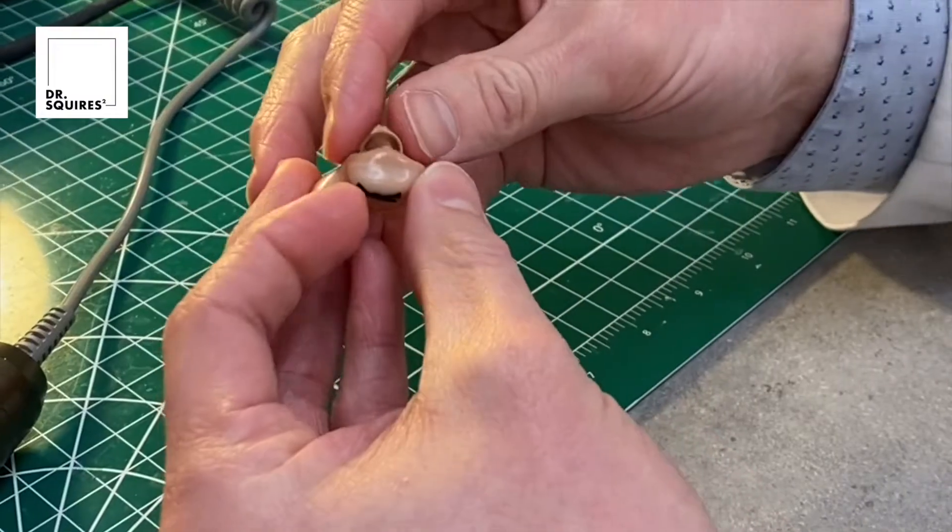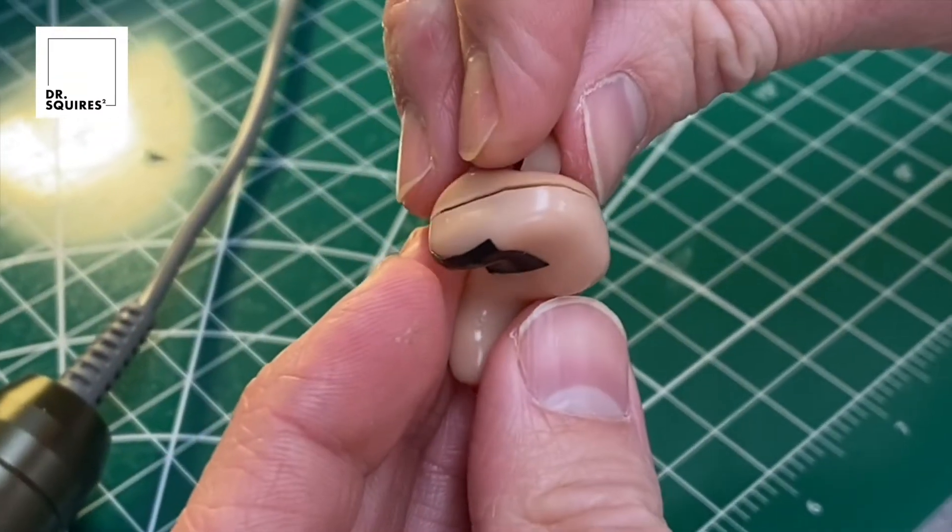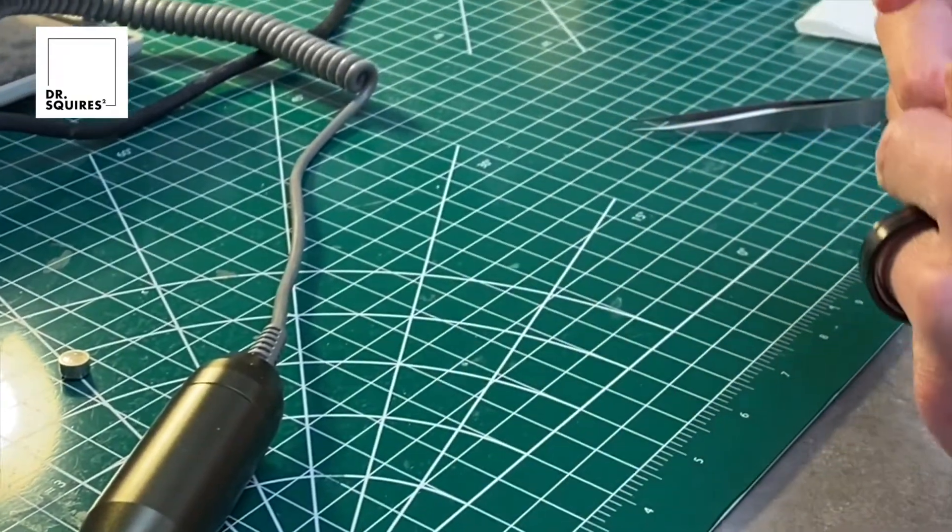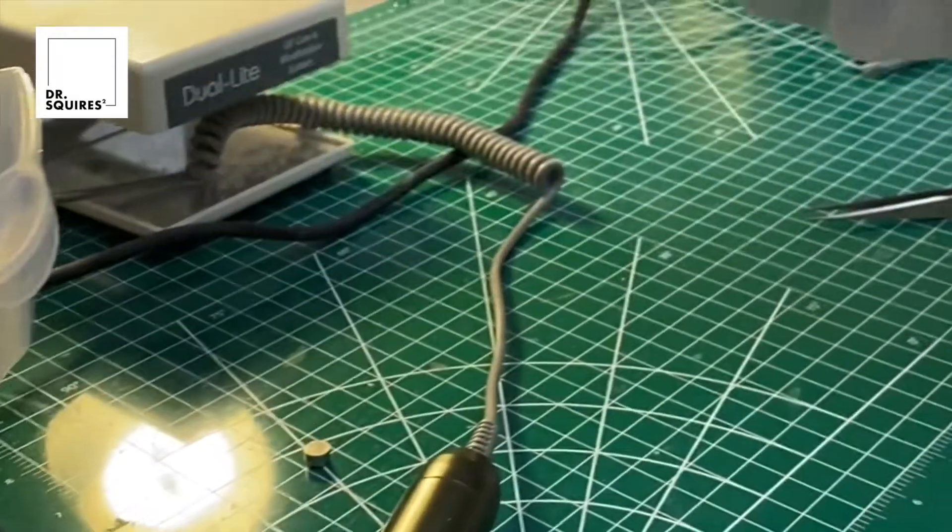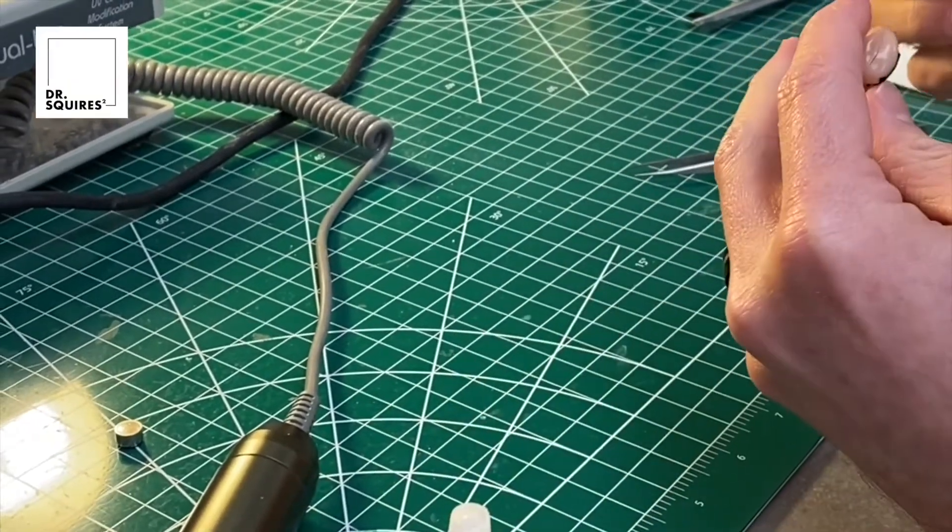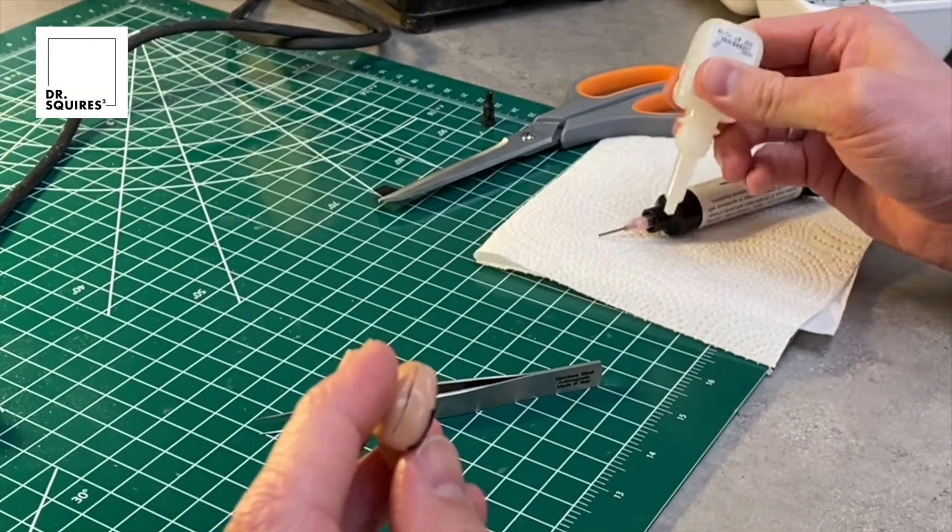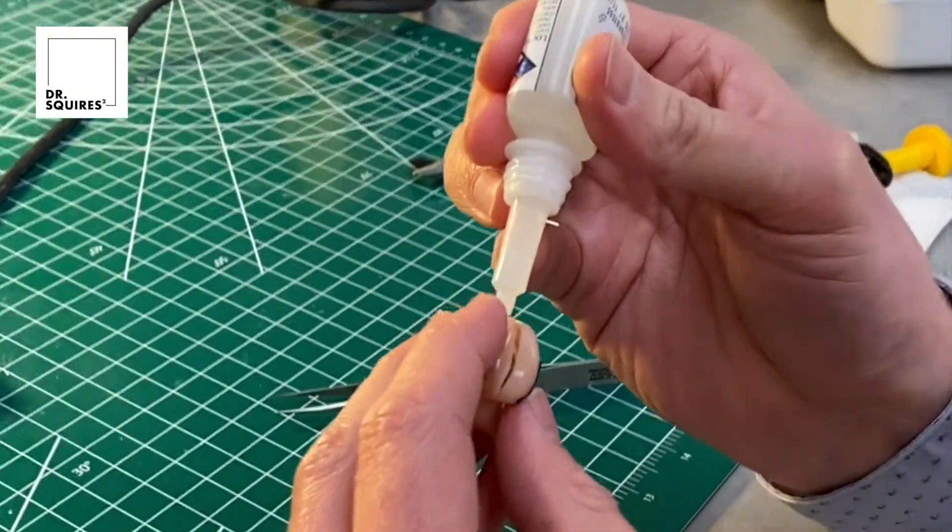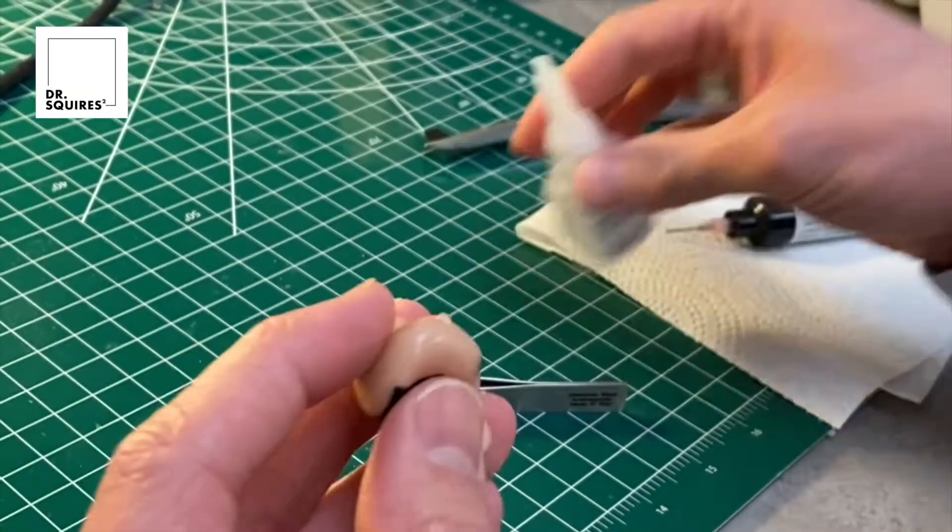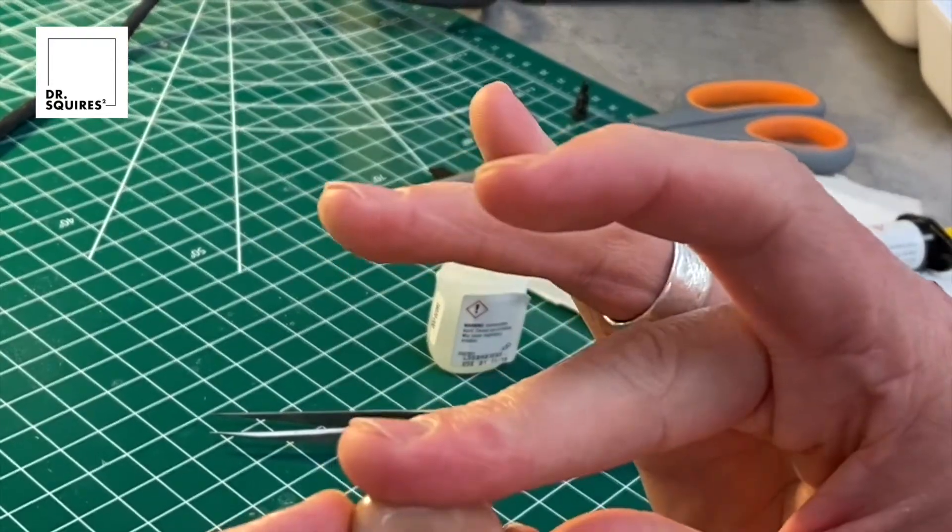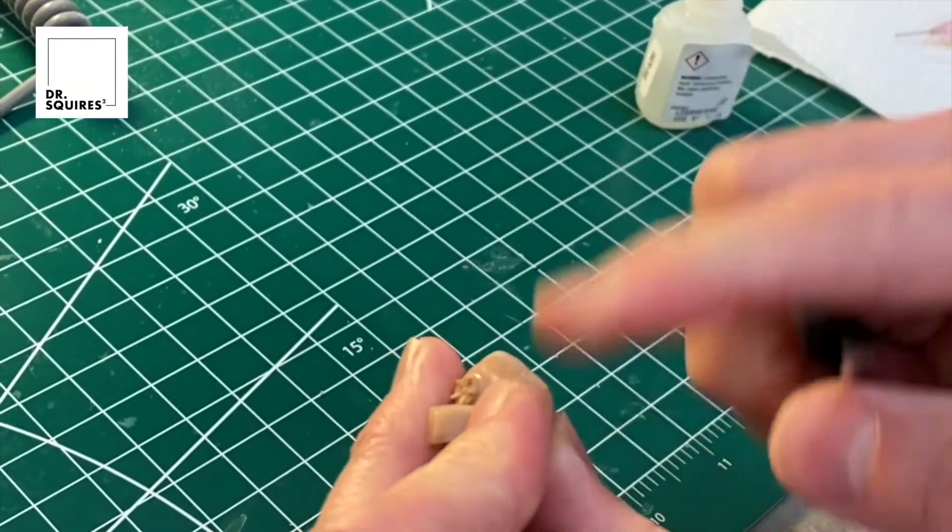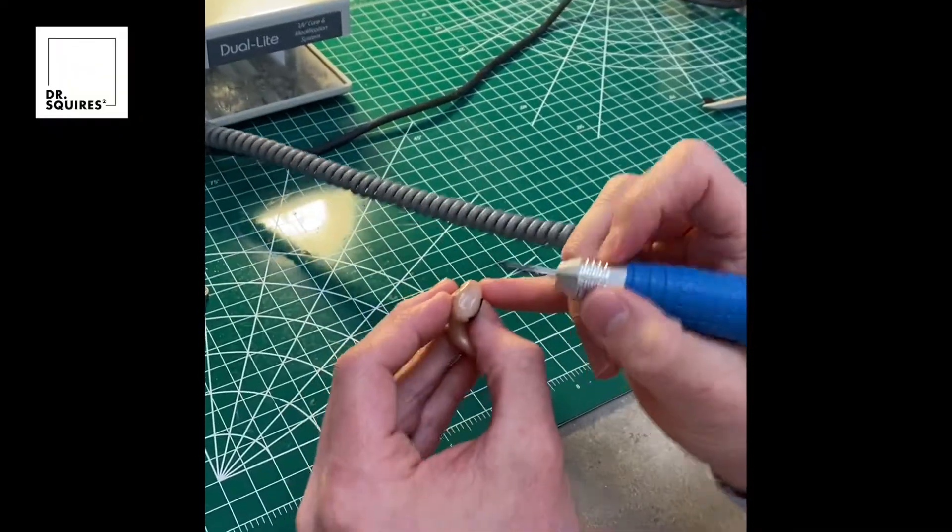You can actually see here that there's a fine crack that runs all the way around the hearing aid. This patient may have dropped her hearing aid, and in a second you'll see that face plate actually lifts completely away from the hearing aid itself. What we'll do first and foremost is take a little bit of instant adhesive, basically a super glue, and just hold the face plate in place to keep it from moving while we're doing the rest of the repair.